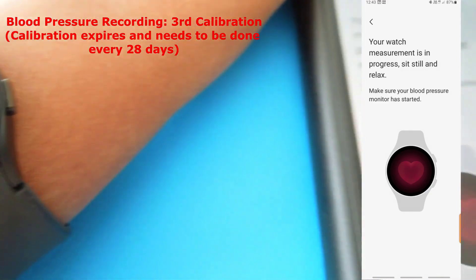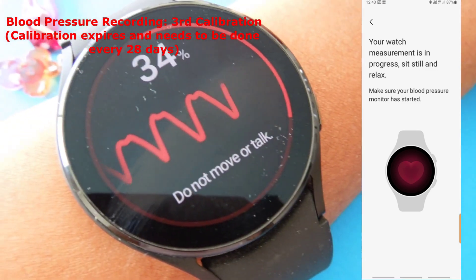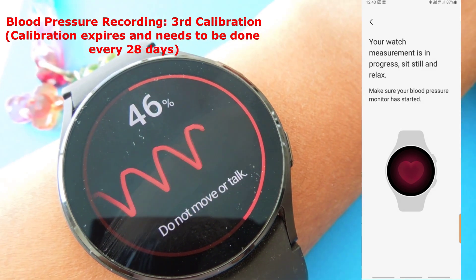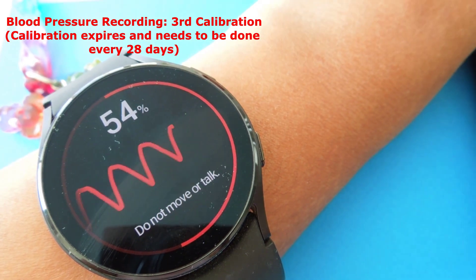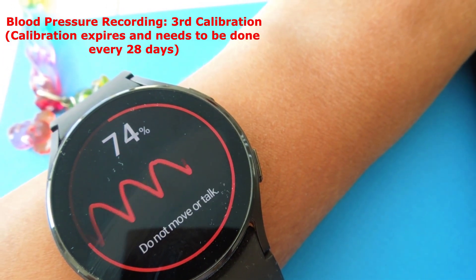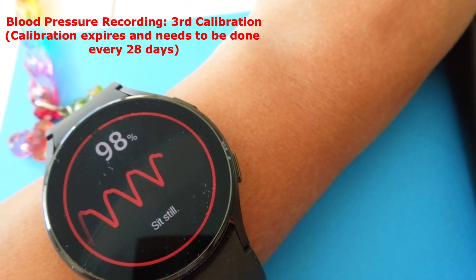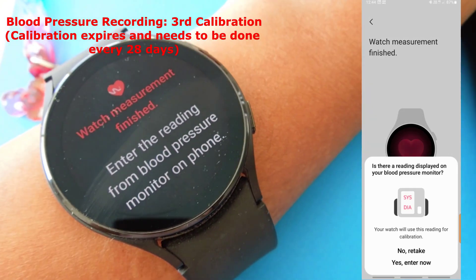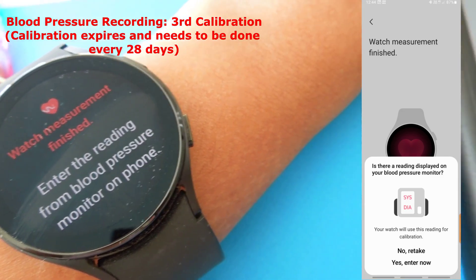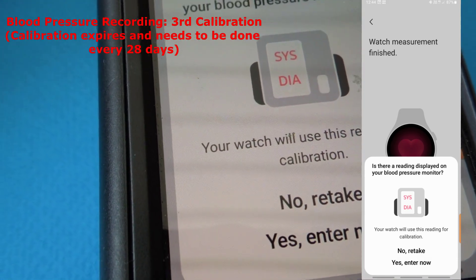Now I'm taking the last measurement. What the watch does is get a feel of your blood pressure and match that with what your blood pressure monitor says. The third reading is complete, and I'm now entering that blood pressure reading on the phone app.